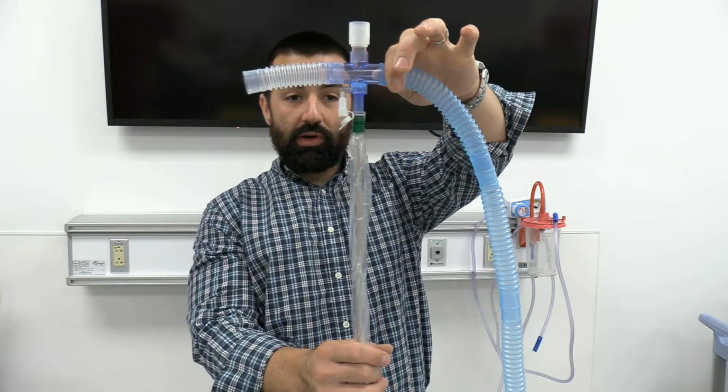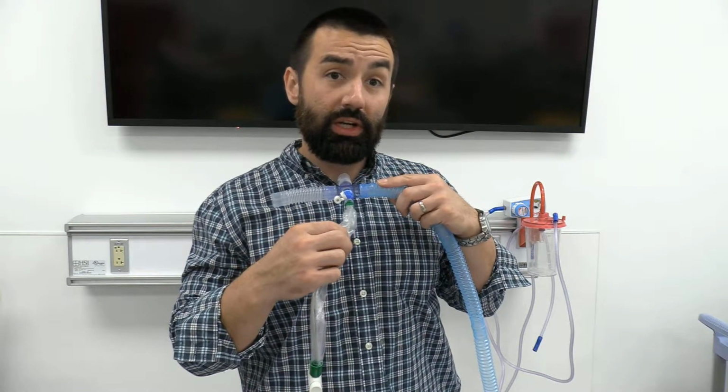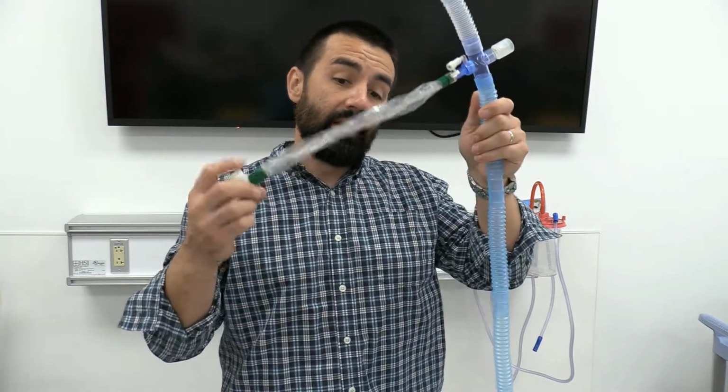It needs to be inline suction that we're turning into a T-piece. You can do the same thing with an ET tube, endotracheal tube. It's not something we do as commonly. And then once again, the benefit of doing this is we have the ability to continue to give them gas as we're going down and suctioning them, okay? And it gives us the ability to do frequent suction without having to do open sterile suction all the time.